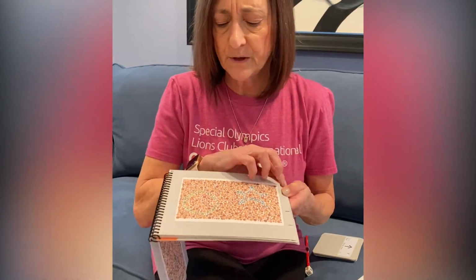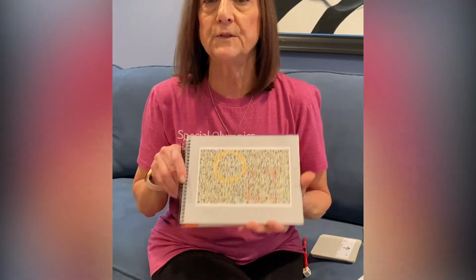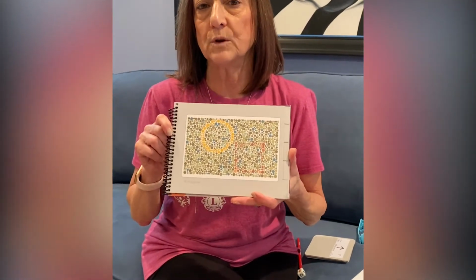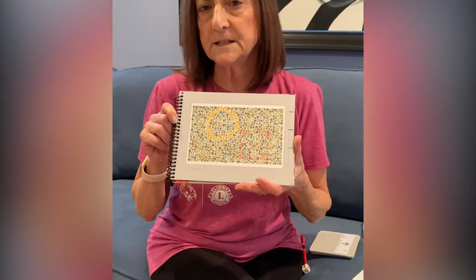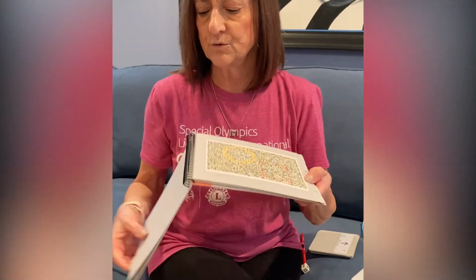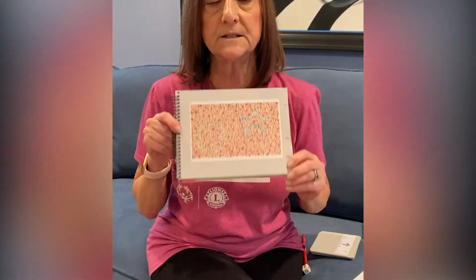There are 9 test plates. You're going to go through the 9. And what we do is we say, if the athlete is able to find that circle in 8 or 9 out of the 9 actual test plates, their color vision is normal. If they get less than 8 correct, we go back to the first actual test plate and we go through the 9 cards a second time.